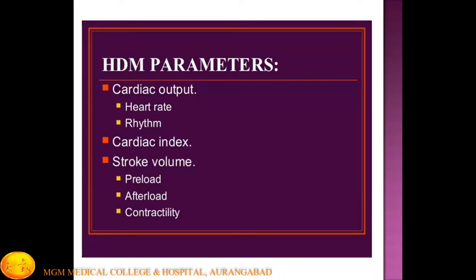In hemodynamic monitoring, we can assess all these parameters one by one, and then we can accordingly treat with volume or inotropes or vasodilators, whatever drug treatment is required for that patient.